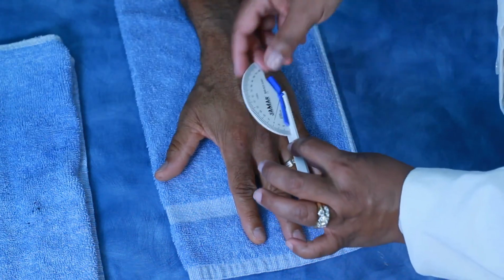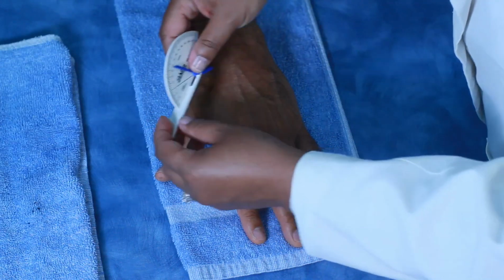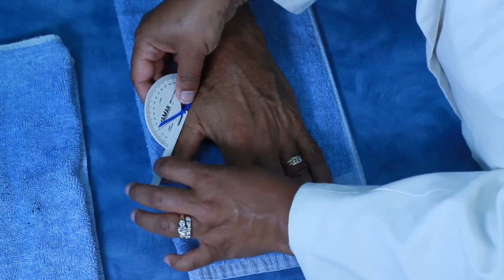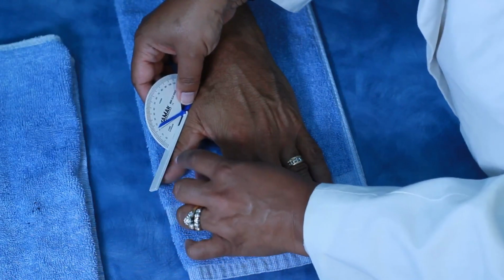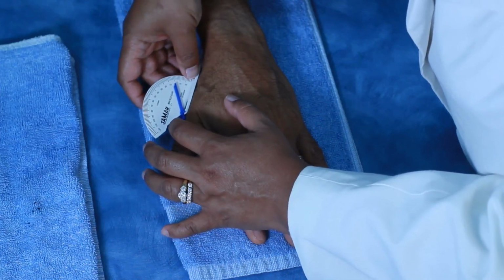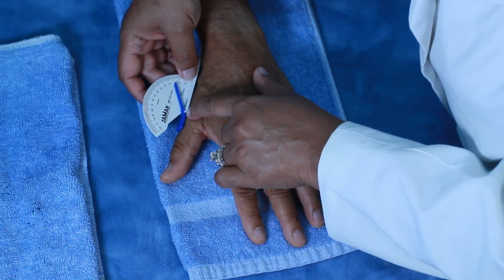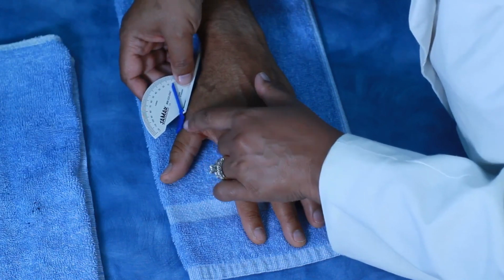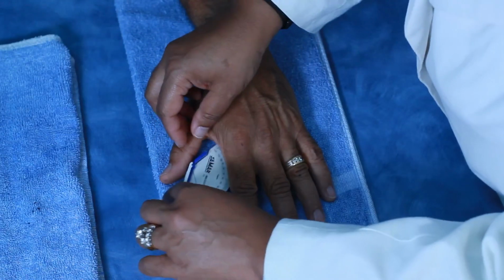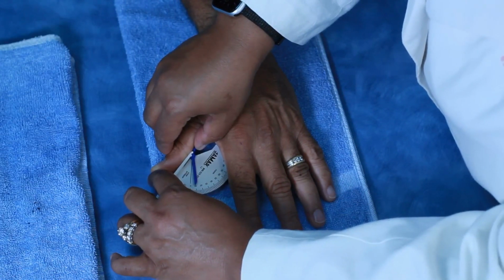Okay, and now we're going to switch to one that's a little bit different to measure the MP and the IP joint. So the first thing we're going to do while he's in this position is to see whether or not he's zeroing out. And I'm going to say this is 5, but there's a gap here. So I'm going to actually turn this so that I can get a more flush, putting the fulcrum on the dorsum of the thumb MP. He's starting at 0, and then here he's got approximately plus 10, and I can kind of tell that if I measure on this side.